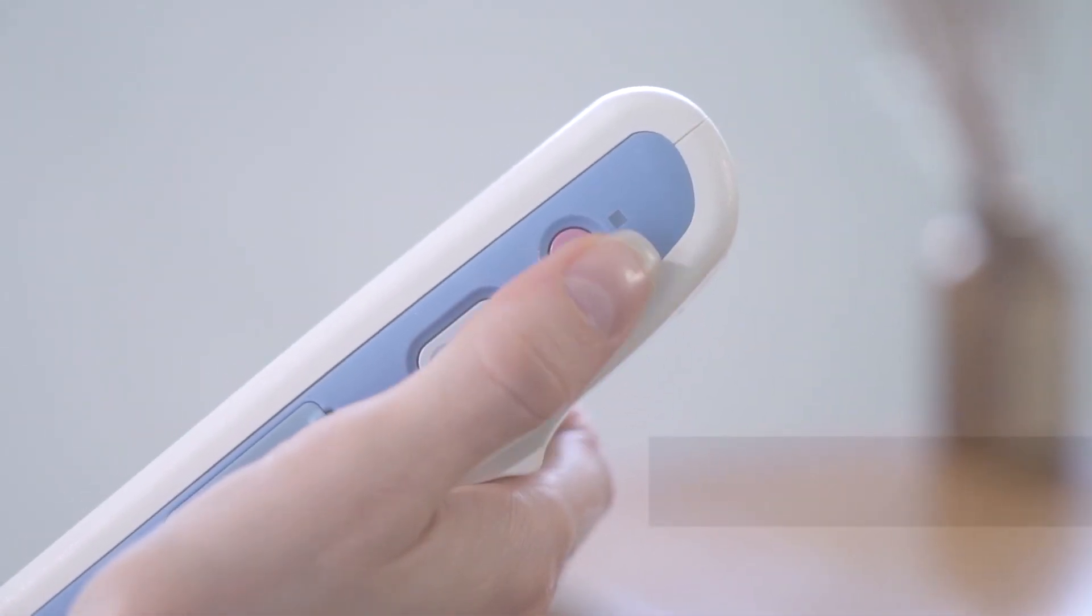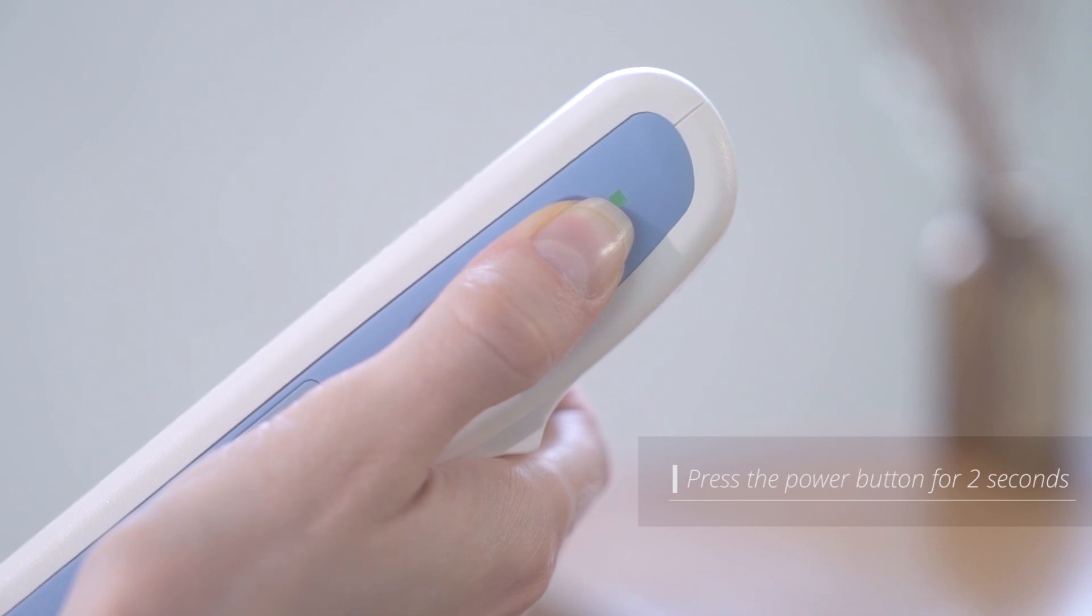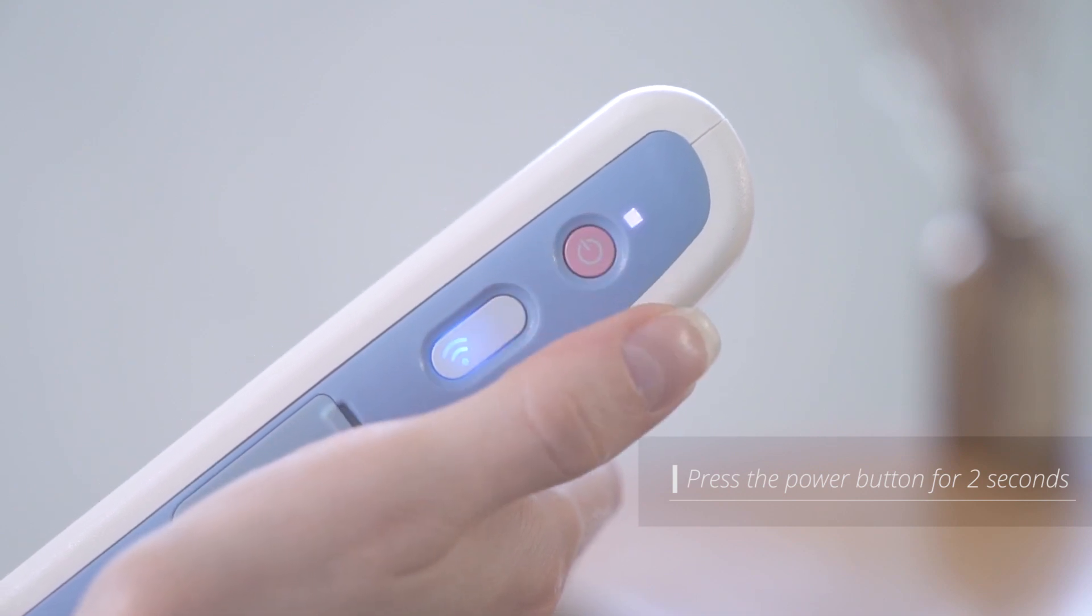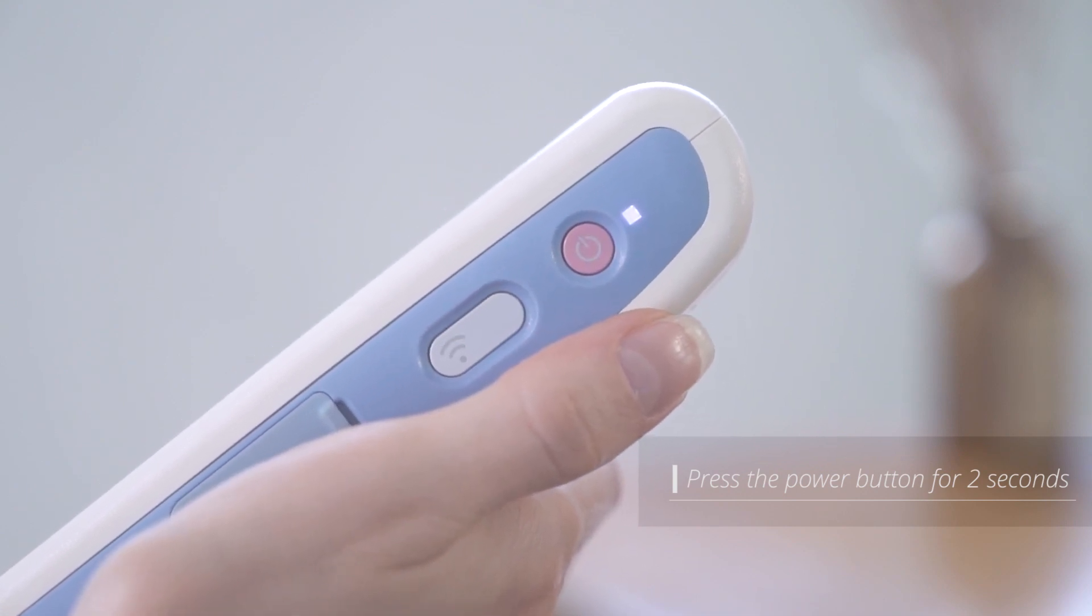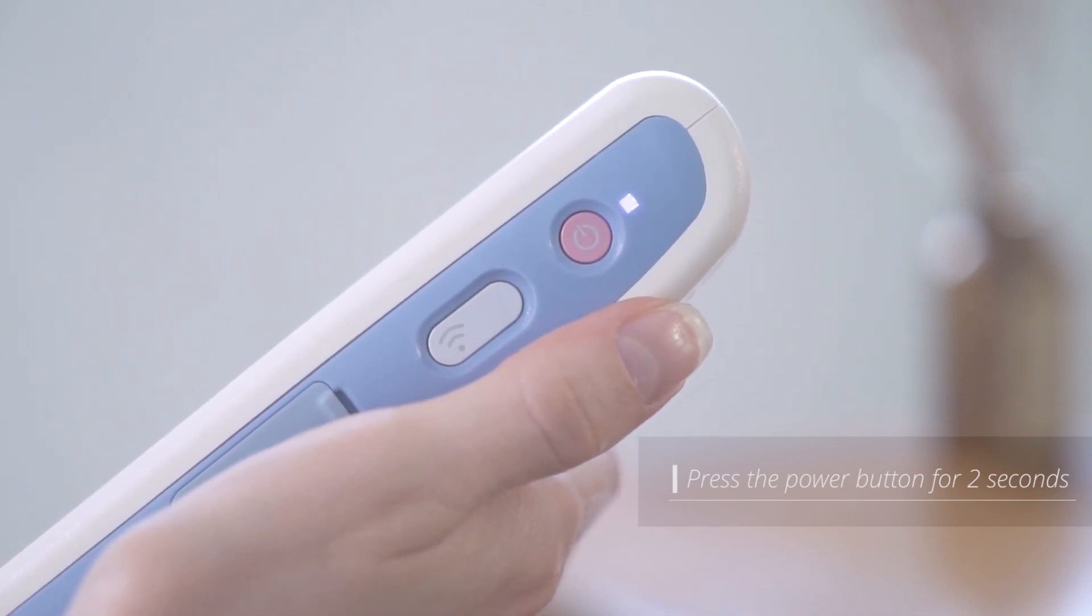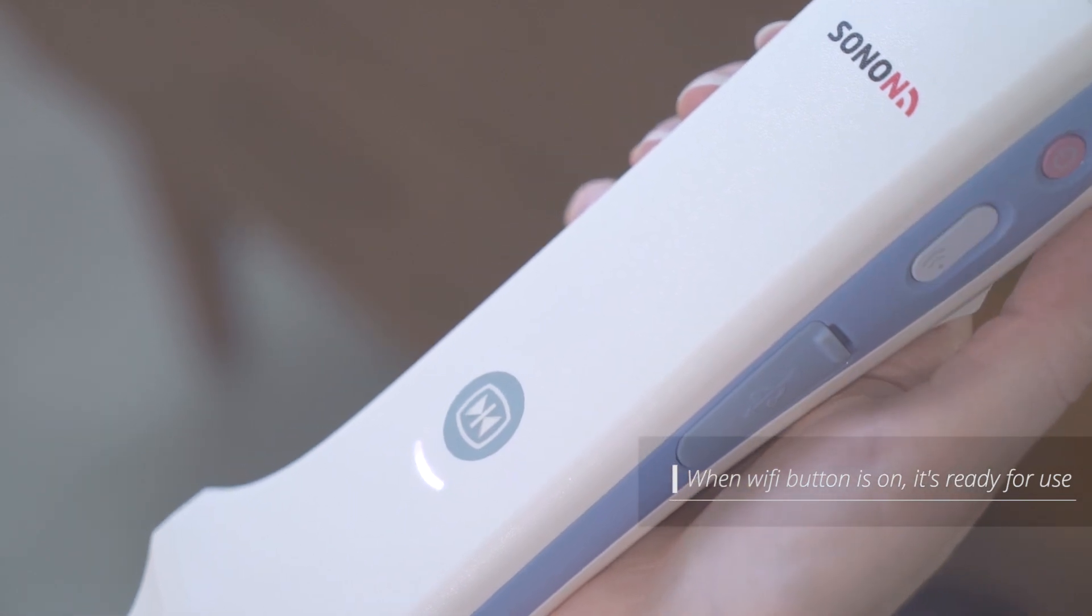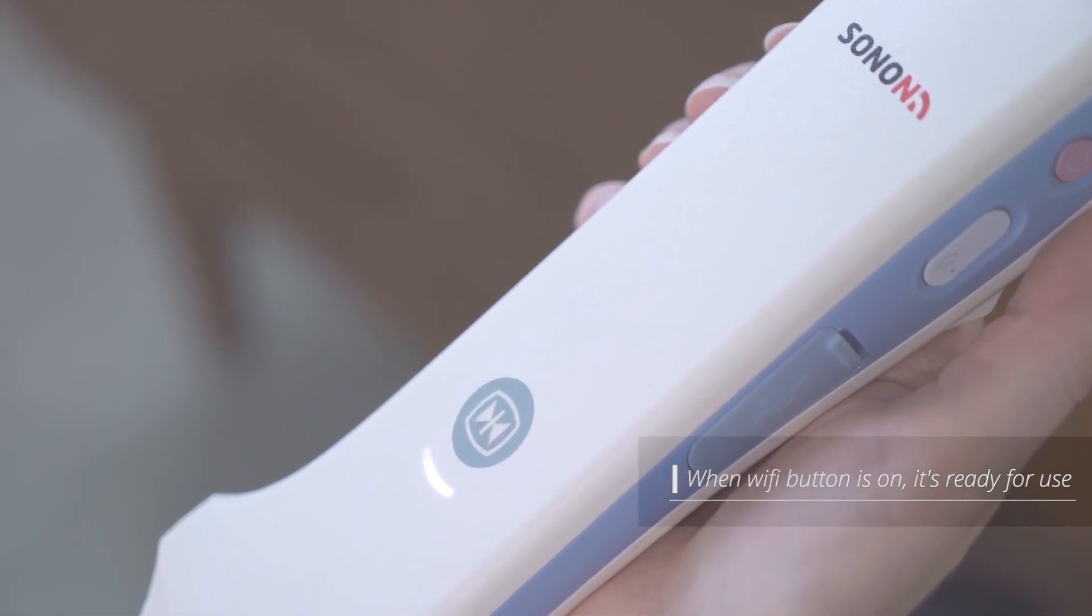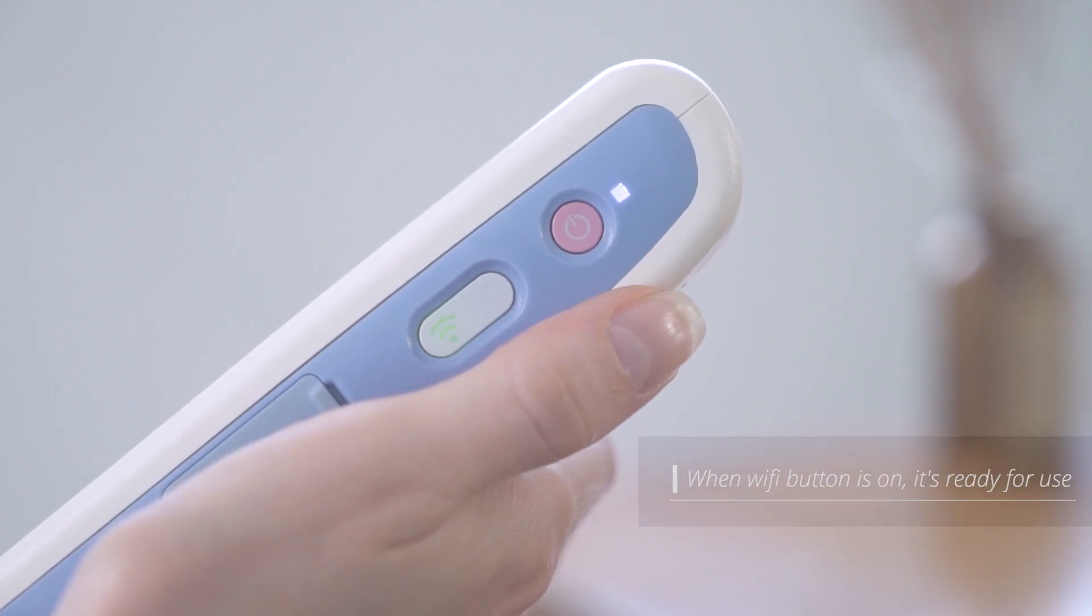Press and hold the power button for about 2 seconds to turn on the device and it will automatically activate Wi-Fi.